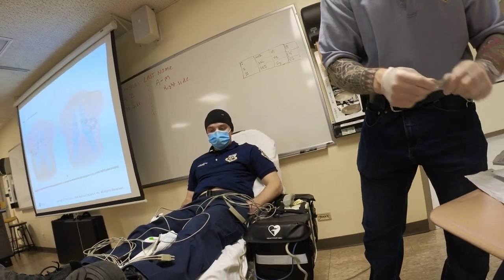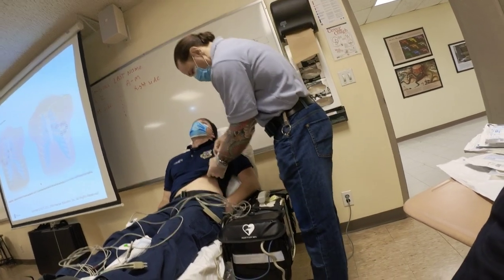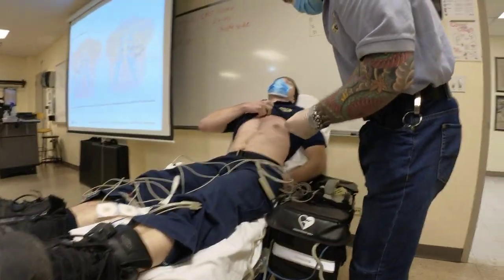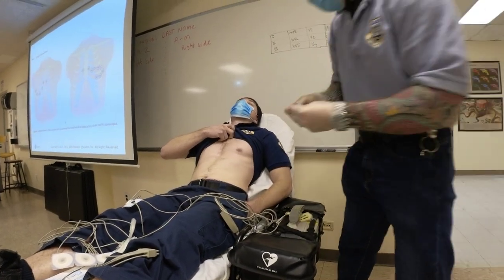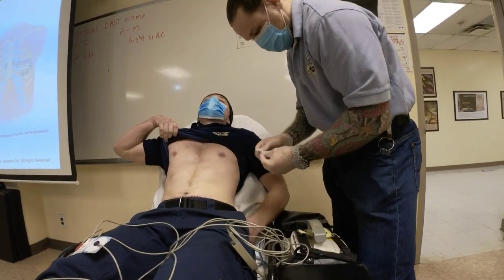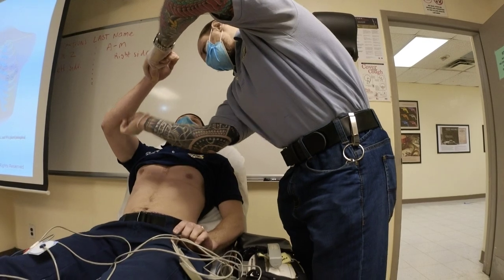All right, if your patient was diaphoretic, I would get a towel to wipe them off. So I'm just going to raise your shirt. You can hold this up if you want. Oh, scandalous. So I clean it with alcohol because I want to make sure, right? First hour in weeks, you know. Give me your arm. And try not to put it over bony prominence. Give me this arm for a second. You're getting too excited.